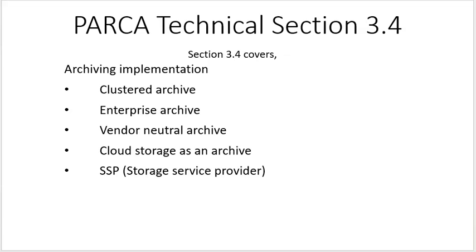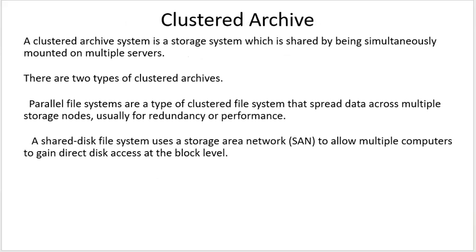Okay, PARCA Technical Section 3.4 covers archiving implementations. We're talking about clustered archives, enterprise archives, vendor-neutral archives, cloud storage as an archive, and storage service providers. So first we'll talk about clustered archive. A clustered archive system is a storage system which is shared by being simultaneously mounted on multiple servers.